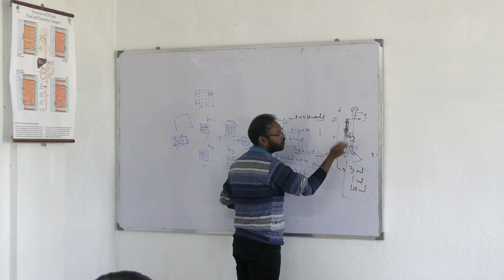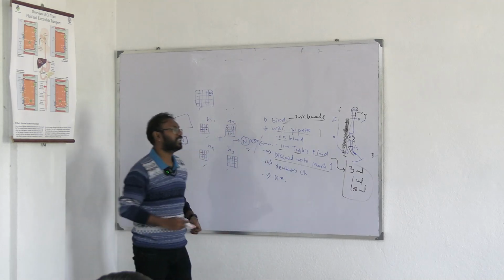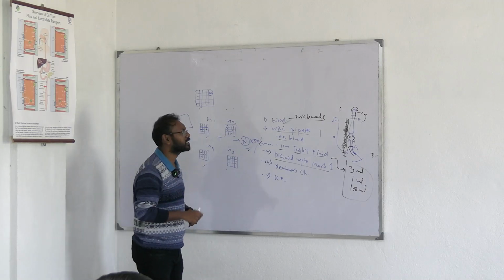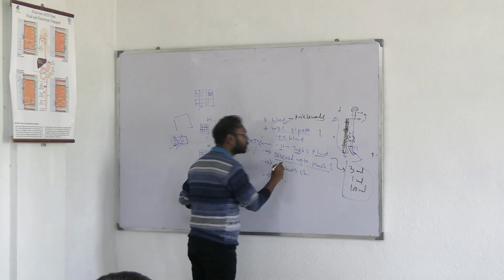Mostly you will see the fluid accumulated in this area. Mostly the mixing happens in and around this bulb. The purpose of this bulb: in hemoglobin estimation there was nothing like this, since we did not need to mix there, so no bulb was necessary in that pipette. But in WBC and RBC this bulb is necessary. So discard up to mark 1.